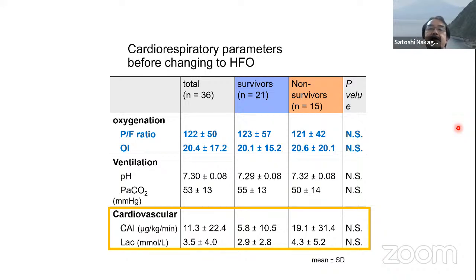So if the patient already has hemodynamic compromise before applying high frequency oscillation, you must apply it carefully, because the patient may have further hemodynamic instability.